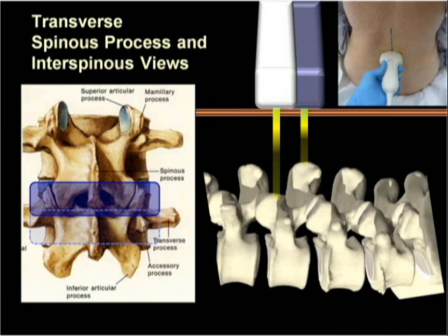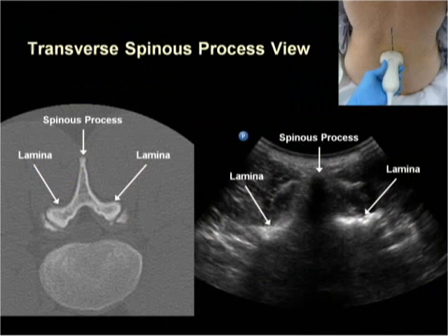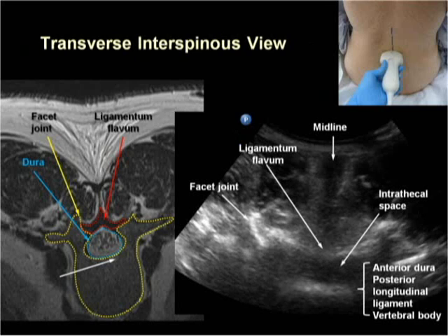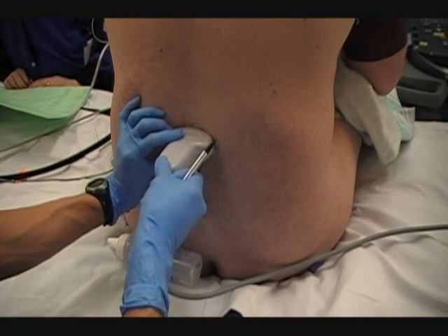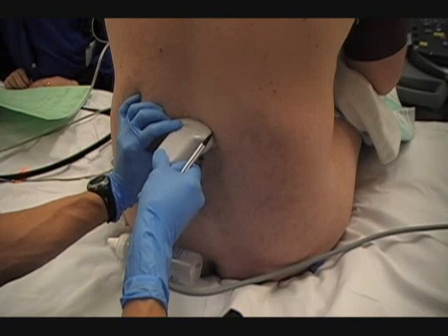The probe is now turned into a transverse orientation to obtain the spinous process and interspinous views. If the probe is placed over a spinous process, the process and the adjacent lamina are recognizable by the acoustic shadow that they cast — this is the transverse spinous process view. Sliding the probe either cephalad or caudad will bring the beam into the interspinous and interlaminar space and give you the transverse interspinous view of the vertebral canal. The probe position may be fine-tuned by small sliding and tilting movements to improve the view of the vertebral canal.